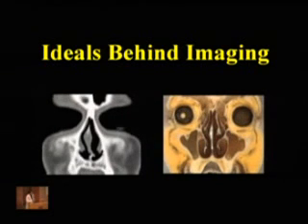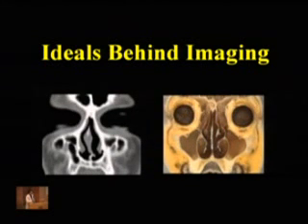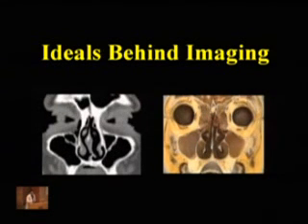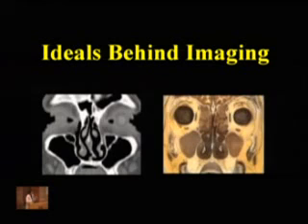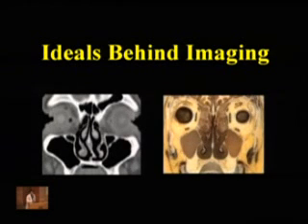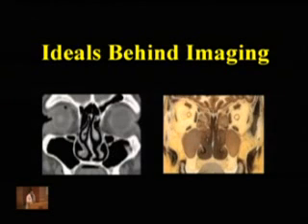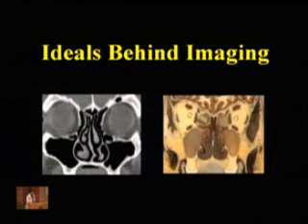This is quite an illustrative video clip that I got, commercially available. It's not from us actually. But I just try to illustrate the ideal that we all should have, which is to reconstruct the real situation in our mind by looking at the CTs.